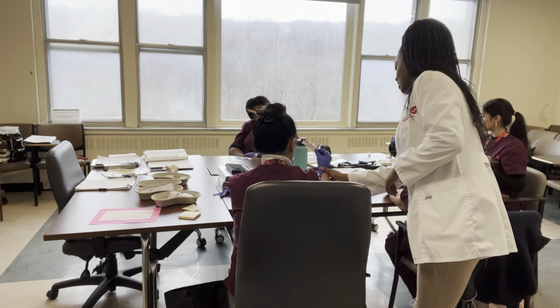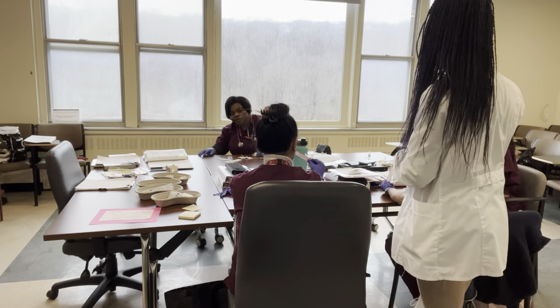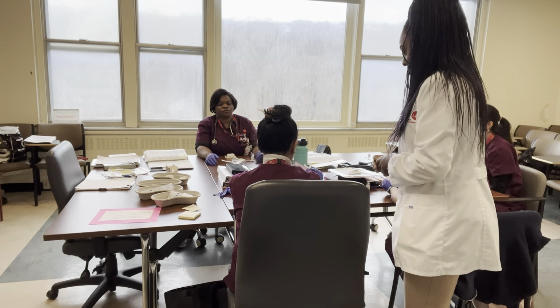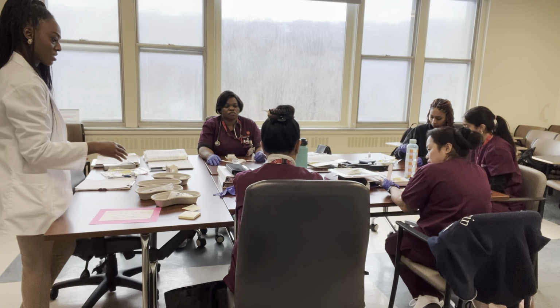Not from up here. You want to get closer to the person's skin. You don't want to jab from all the way up here and then go into the patient. That's very bad. You want to get closer to the patient's skin. Then I'm gonna tell the patient that it hurts, but just a little bit. So be a little bit closer to the person's skin. Okay.